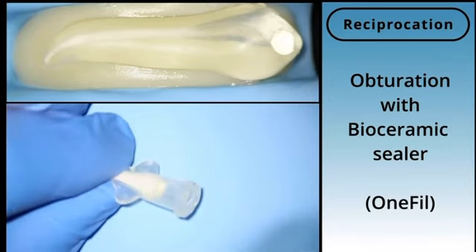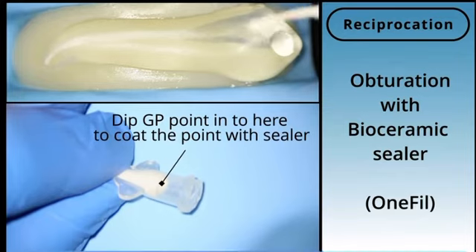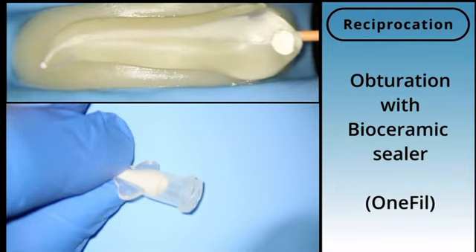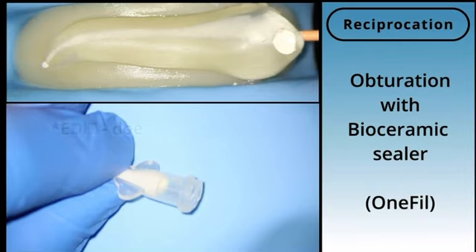And you'll notice on this case, we have quite a significant extrusion of bioceramic sealer. But there's an argument to say that this type of extrusion actually isn't a major issue, and some people would argue that it is associated with quicker healing. I'm not too sure about the evidence in that case, but what I noticed with this bioceramic sealer is that once you take a 1 year post-op, you will notice that that bioceramic sealer has been completely absorbed by the body.